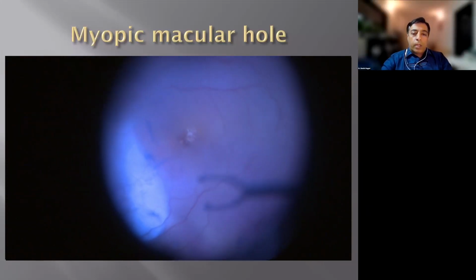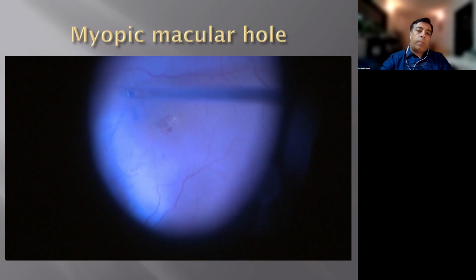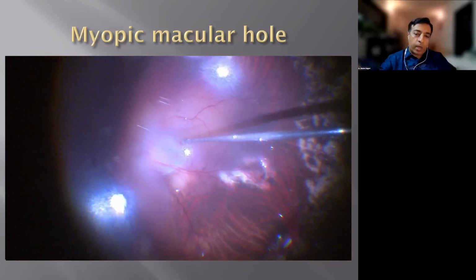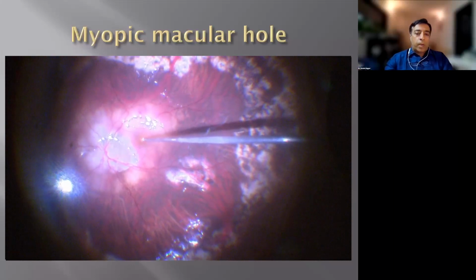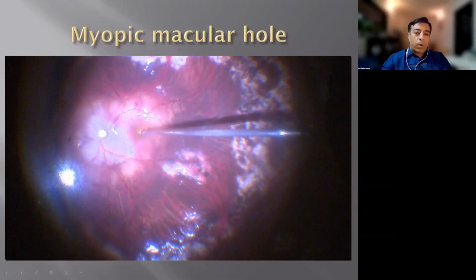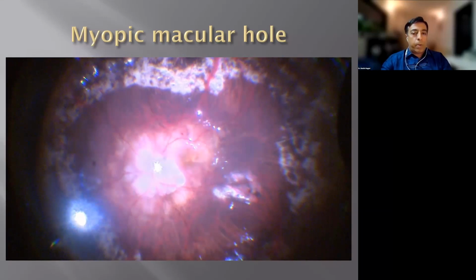So in this, I got a sheet earlier, but I suspected there is more ILM there than what I saw, and maybe that was more like a hyaloidal sheet. And so you double stain at times to double check that there's no ILM left around the hole. And after that, the retina will get more malleable and will flatten more. Now, this patient, as I told you, was vitrectomized earlier elsewhere, was stable, and at some point had detached again with a macular hole.